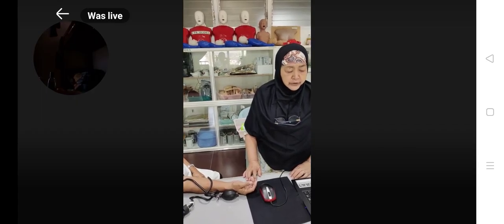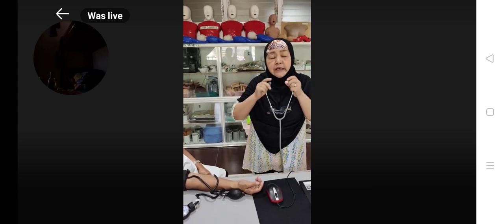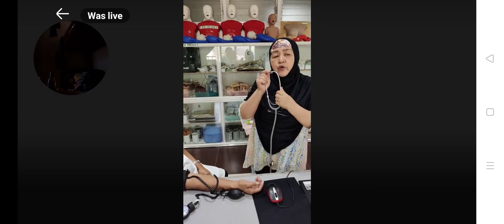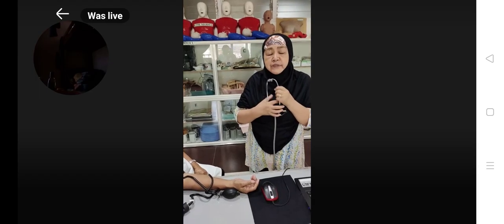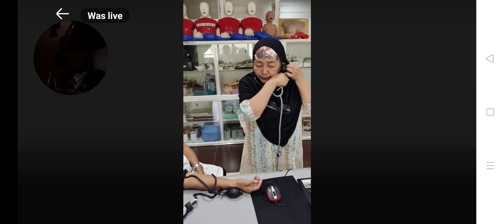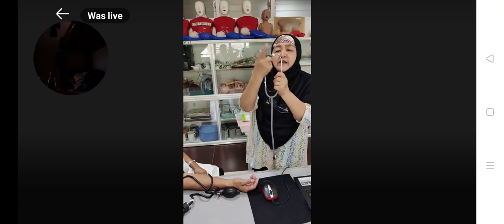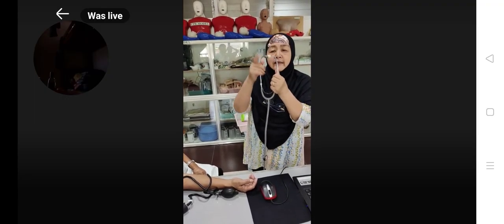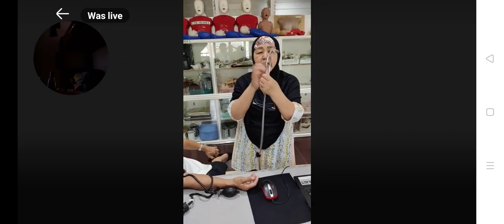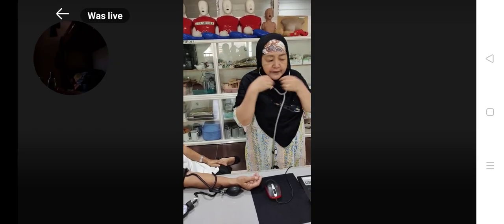Okay, then you are going to position your stethoscope. Before using, it should be cleaned also, because microorganisms can harbor on it. You see the angle, it should go in like that, not like that. Okay, it should be like that. So you have to insert it in your ears, placing the bell or the amplifier of the stethoscope.